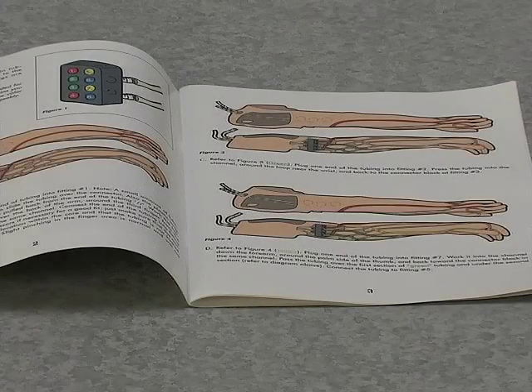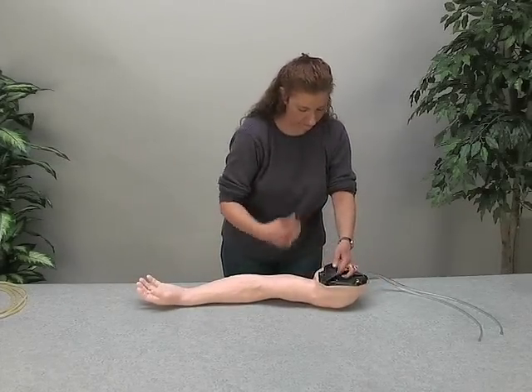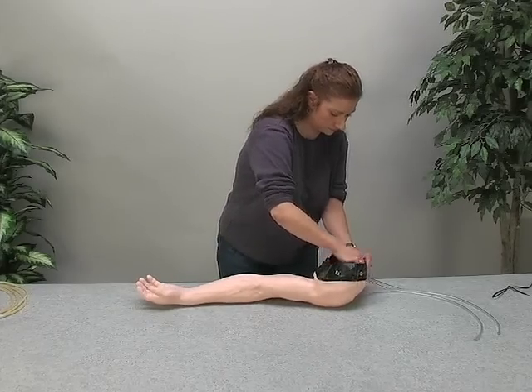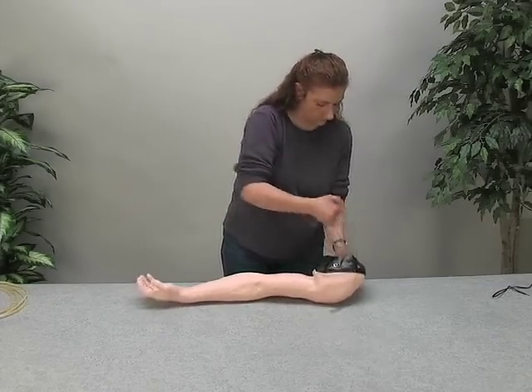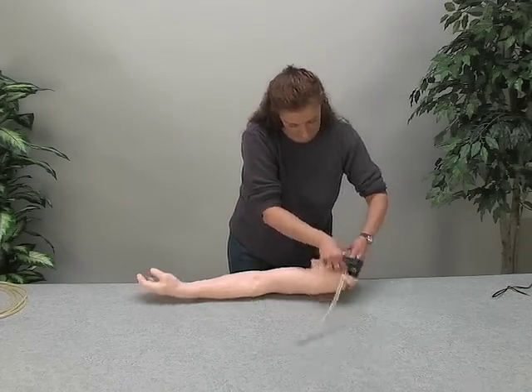The first step is removing the used skin and veins from your existing IV arm. Untie the string from around the shoulder opening, then take the two inlet-outlet tubes out of the arm skin and pull down the skin from the arm.